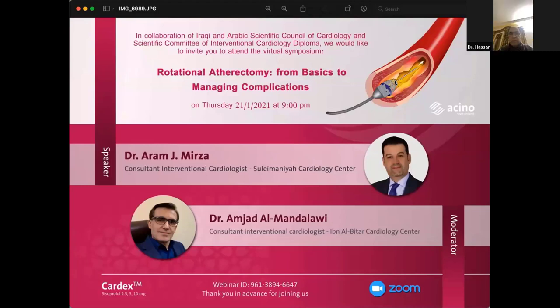Jawad Hawass was asking about the optimal duration of temporary pacing. I think you answered that question, that temporary pacing is no more used or is used less than before. But as an advice, I think anyone who is going to start rotational atherectomy should use temporary pacing for a dominant circumflex, for left main stem, or for right coronary artery. We had, I think, 2 to 3 cases that got heart block, and without the temporary pacing, we might have had some emergency situation in the cath lab. Although now they say that if you use frequent atropine during bradycardia, you will not need the temporary pacing, as we said. So there is no optimal duration for such a thing. It depends how long the patient will stay in heart block. Yes, that's right. Okay.